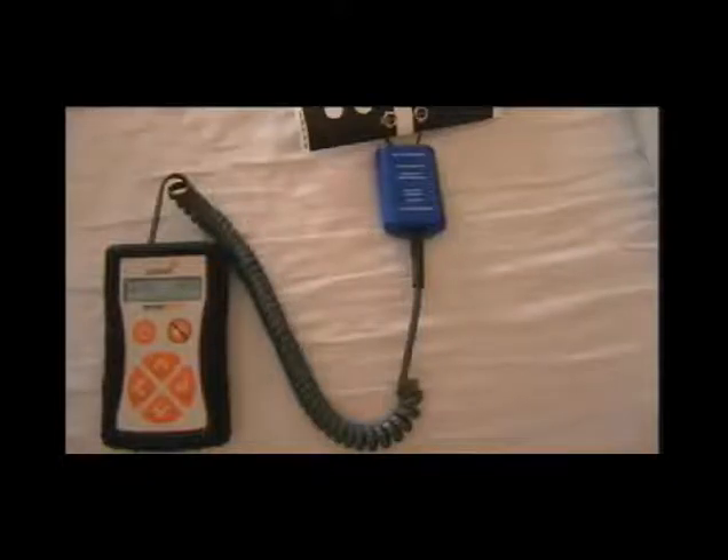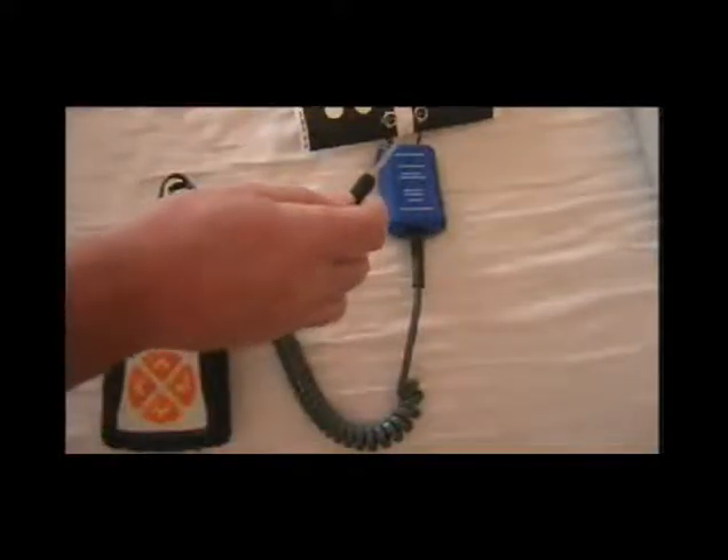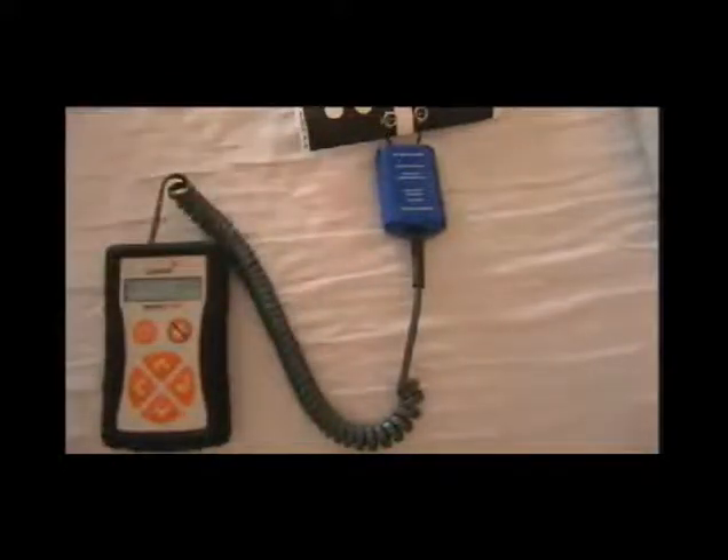The Sensormate 2 paper thin Tyvek sensor kit comes complete with all the components required to monitor a bed or a chair. After configuring the Sensormate for the specific customer requirements, connect the component parts as shown in the video. Note that the interconnecting lead from the Connex adapter is plugged into the left hand input on the Sensormate.